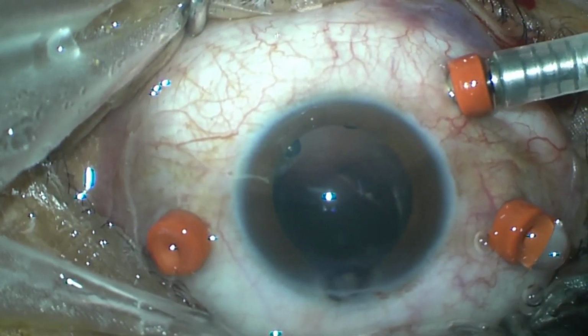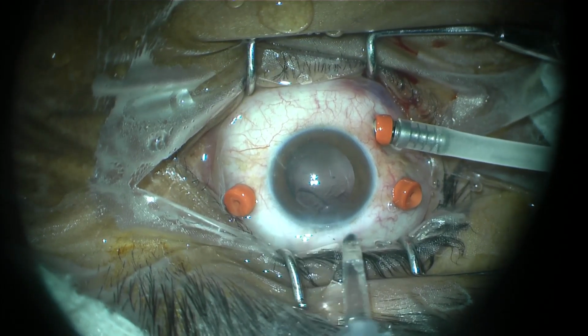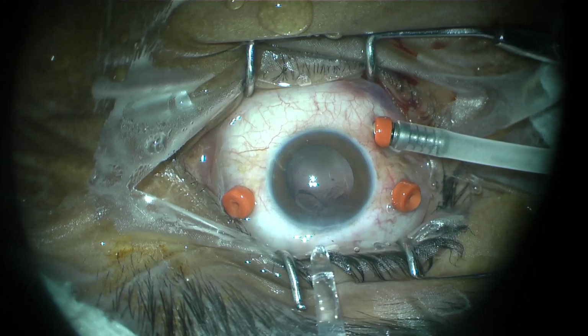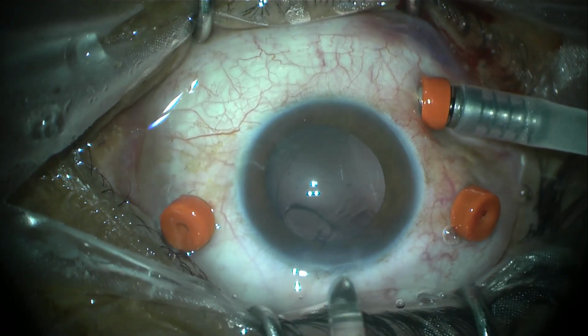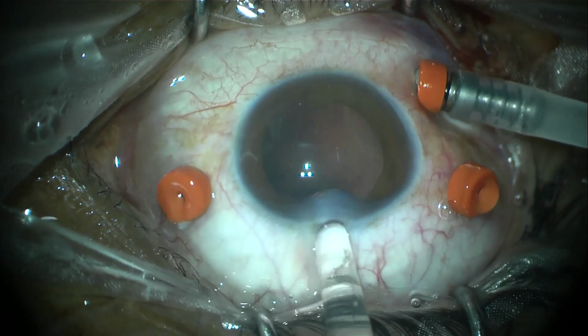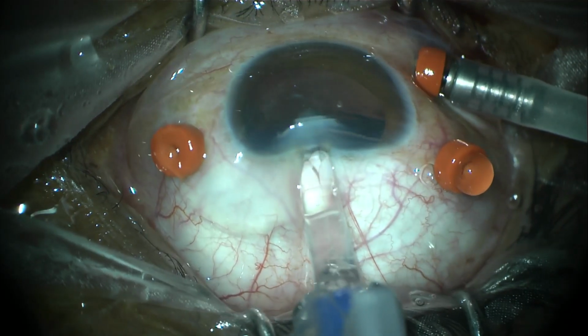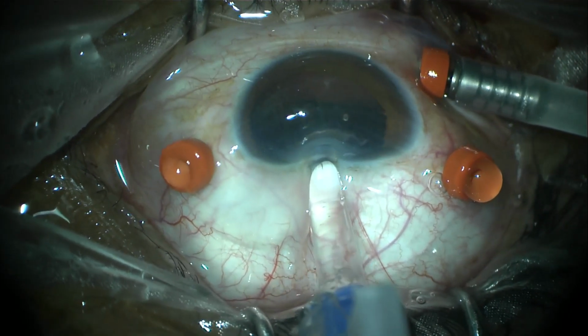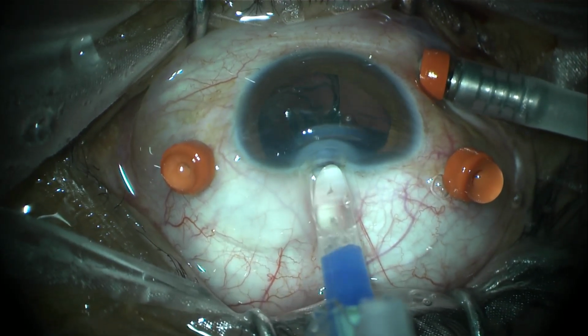Now it is time to do the remaining steps of the surgery, which include implantation of a posterior chamber IOL, which we will implant in the bag because the posterior capsular opening is very small and the posterior capsular periphery is very much intact, on which the IOL can be supported. This would be the most physiological situation for the IOL placement, and it will not disturb any other structure and would be the preferred choice.